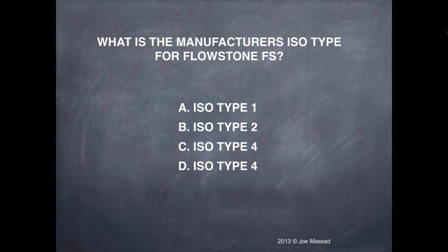At the beginning, you may think it's too quick, but what our residents at the university said, gosh, at the beginning I thought I had to be fast. Now I've done it 4 or 5 times. It's great. I don't want to spend time. Once you get it down, it's real simple to do. But I would say 165 is your good level. I would not go to 175, 170, you know, it's going to actually be too warm probably for the patient. But 165, and the cool rate is very rapid.